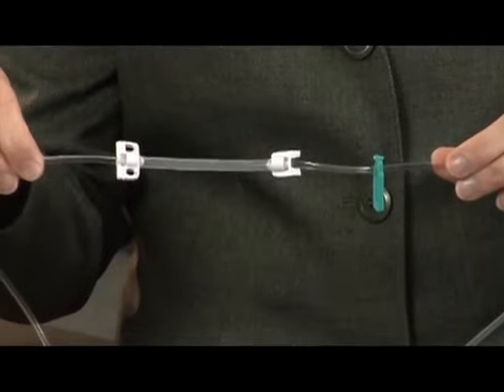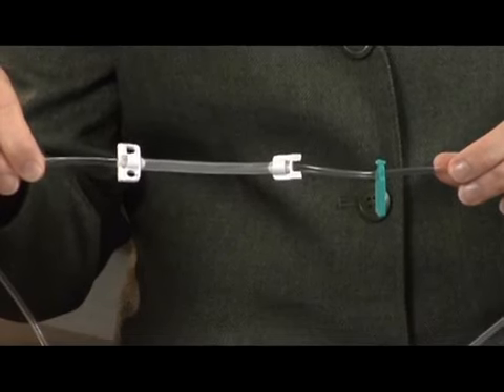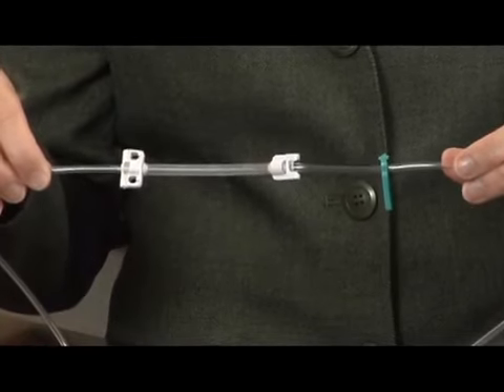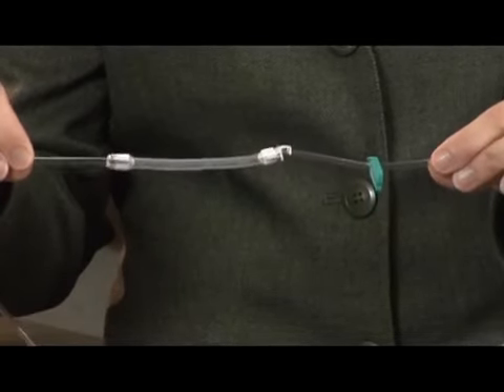The Space Infusomat IV Set is a dedicated straight-line DEHP-free set. It utilizes a silicone pumping segment with clips on each end that secure to the pump and a green free-flow protection clip. The green clip is in the correct loading position upon removal from the packaging. Do not reposition it up or down the tubing.